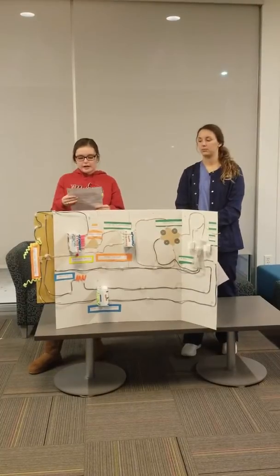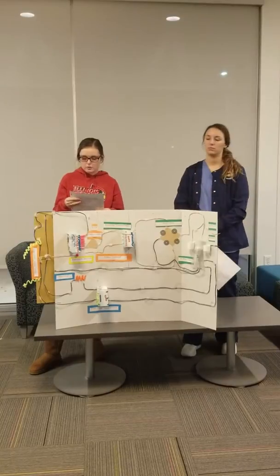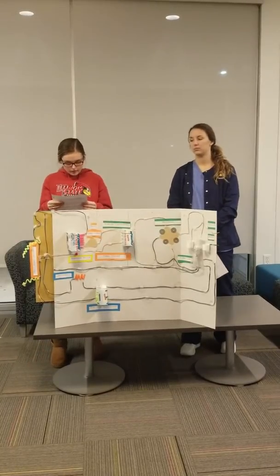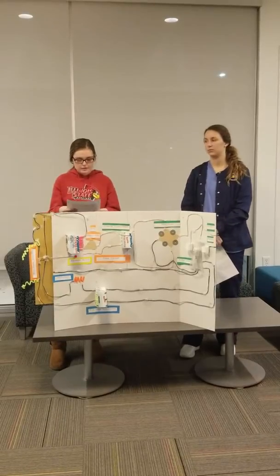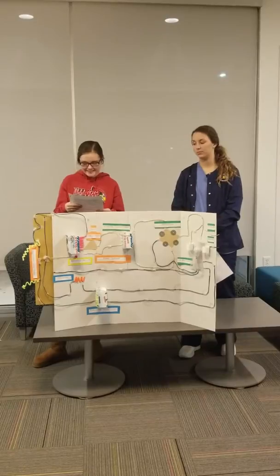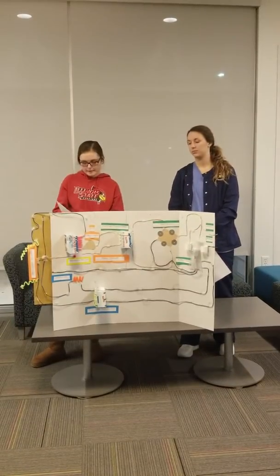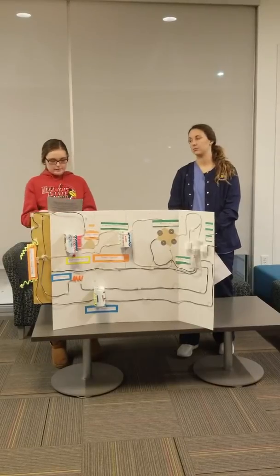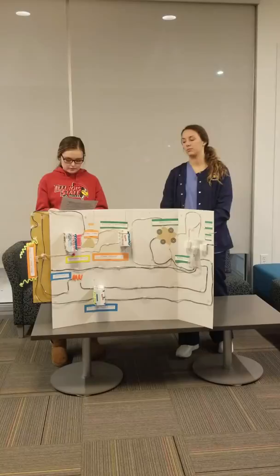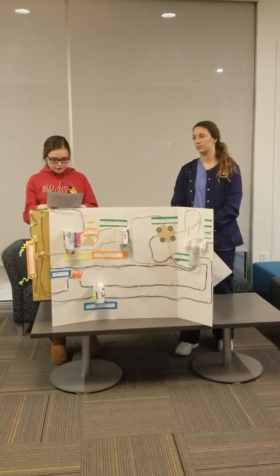The exposure time works with the rheostat, and together they determine the quantity of the electrons boiled off of the filament. And then it goes to the step-down transformer, which increases the current by reducing the voltage that is applied to the filament. And then the final piece of the filament circuit is the filaments, and these are tiny coils of wire that are housed in the cathode of the X-ray tube.